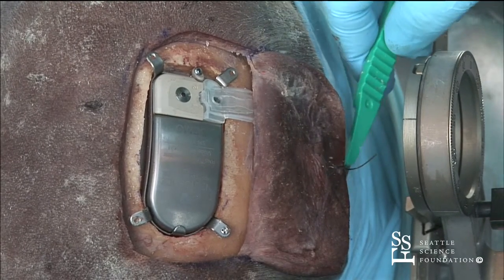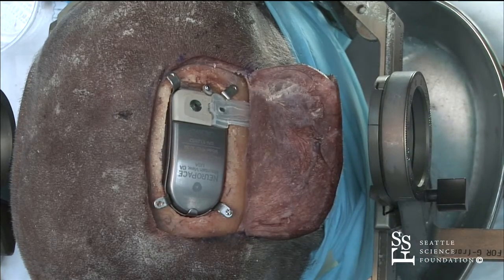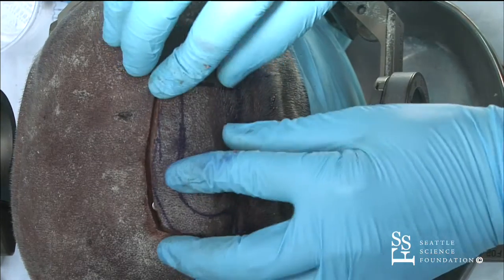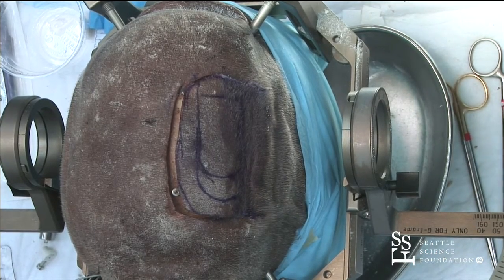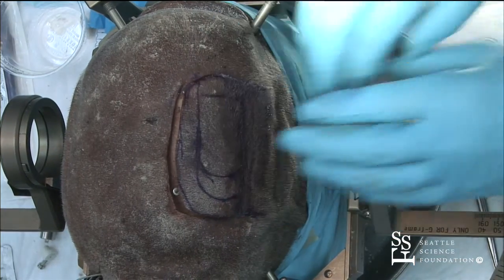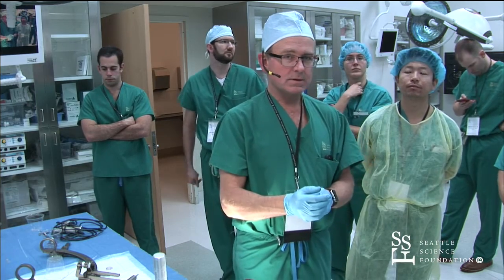And I do all of these cases now with the ROSA, and so we're actually doing it right through the bore of the ROSA. As soon as we're finished placing the electrodes, we will get a scan and verify that it's in the right place, and then go ahead with the RNS implant afterwards. So generally there's 3 incisions, 1 for each of the 2 depths, and our parietal incision here. So that's it. Any questions on the RNS?